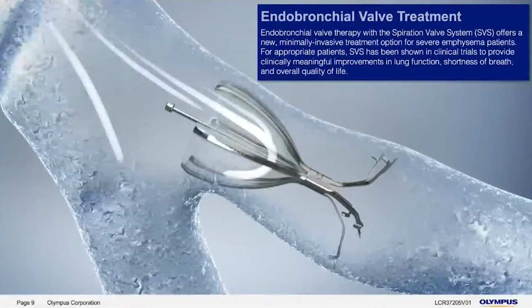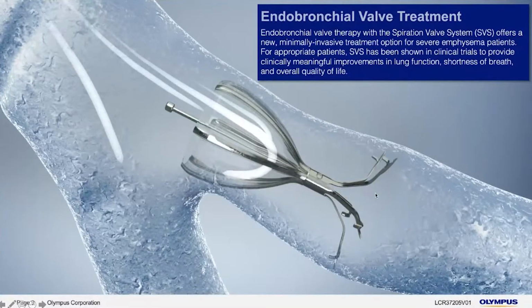So this is essentially what they look like. It was stated earlier, it's sort of an upside-down umbrella. Schematically, the concept is quite simple. If this airway is the area that heads off to the extremely damaged lung, think of it like a branch on a tree that's dead, and this is the airway that heads off to the healthier portion of the lung, then why would we want to send any air to the sick part? We'd want to be shunting everything we could to the healthy part.